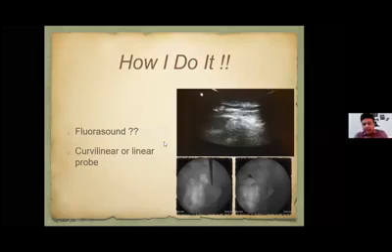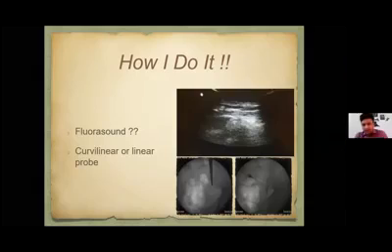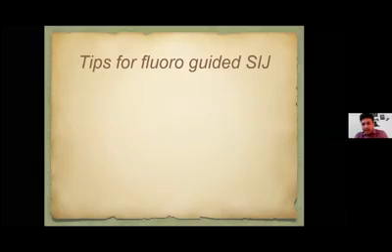What I usually do is check with fluoroscopy after I have placed the needle inside the joint via ultrasound. After that we can give the contrast injection and see if we are inside the joint. So it is better to use fluoroscopy along with it. Although there are critics who say there's no use for it when you are doing ultrasound, I use fluoroscopy along with it.